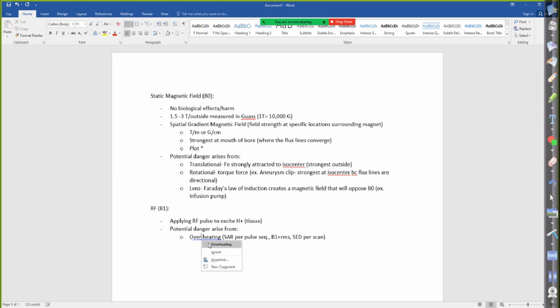So that's overheating. But then we had burns. And remember, burns is the most common adverse event. So from that lecture by, I think it was Miss Sawyer, she kind of really hit on that, right? She was like, people don't really, they're not concerned with this in clinical, but it's the most common thing, so why are we not more concerned about it? Sometimes it really is some of those urban legends about certain scanners won't burn a patient.